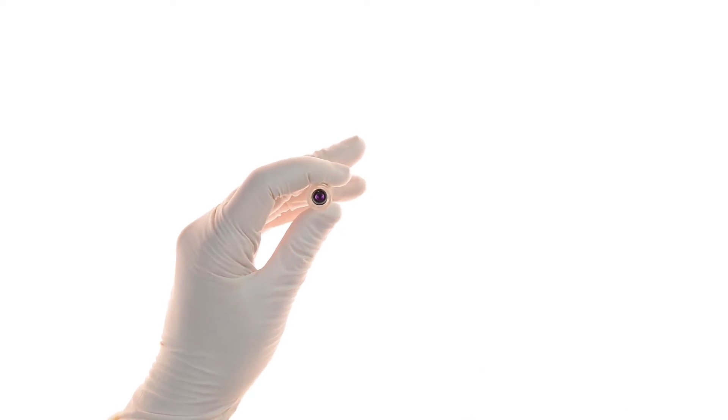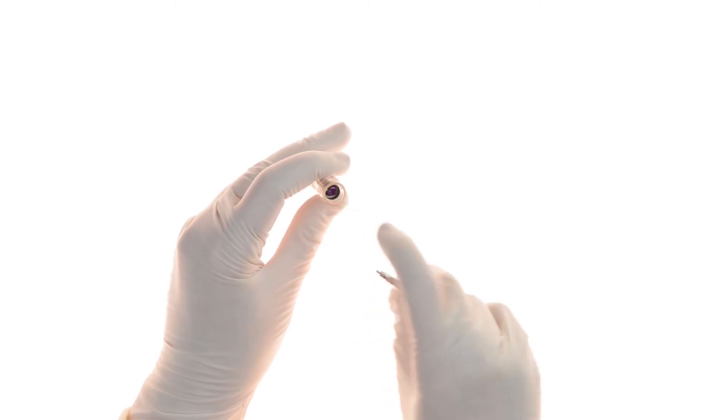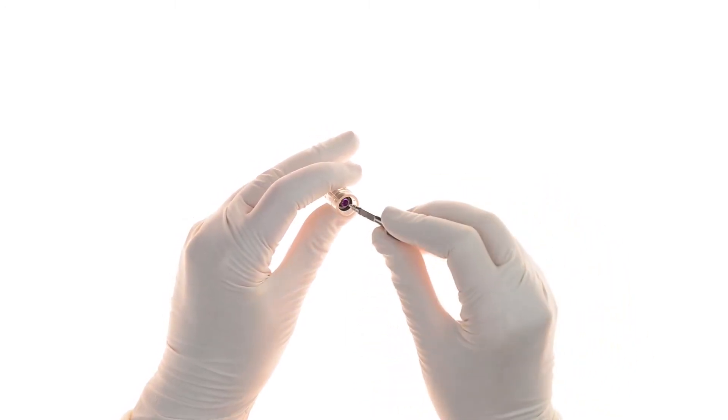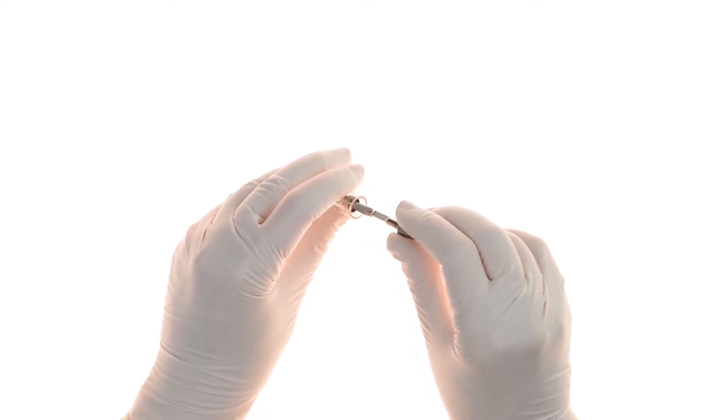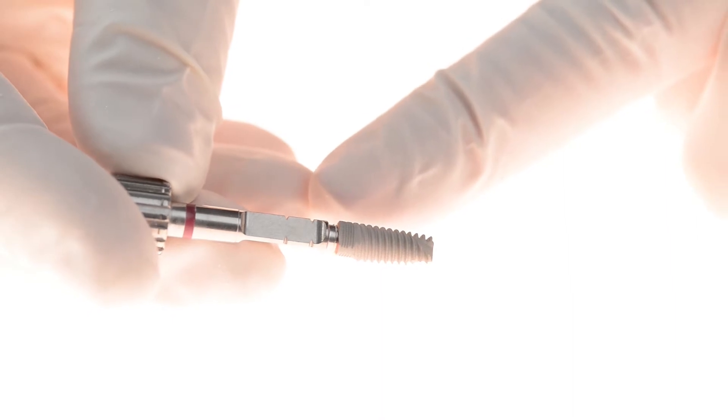The V3 is easily removed from the internal packaging using an insertion tool. Thanks to the anti-rotation mechanism of the packaging sleeve, the flat walls of the tools correspond to those of the implant and make this step of the process more convenient.